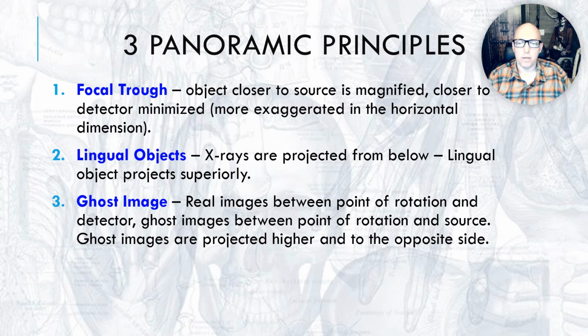And so I've summed this up into just 3 overall principles that you need to know. Really trying to simplify it. Maybe it oversimplifies it, but maybe you don't have to understand every single geometric principle to understand how panoramic radiography works, at least to the point where you can interpret what's going on.